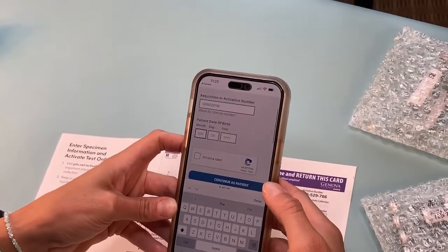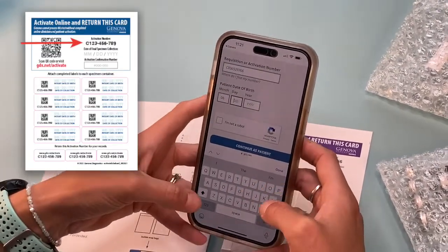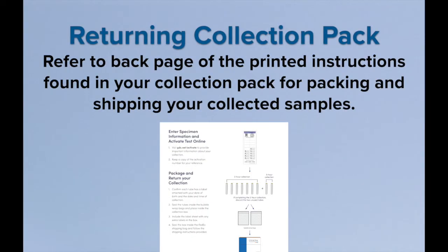Visit gdx.net/activate and enter the number found on the activation label card included with your collection pack. Refer to the back page of the printed instructions found in your collection pack for packing and shipping your collected samples.